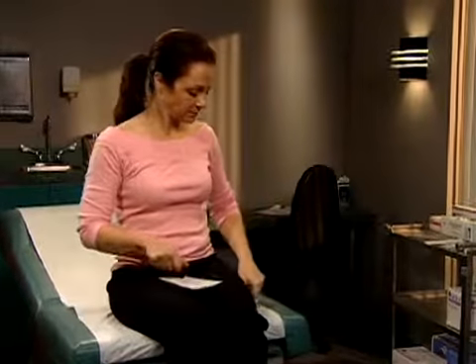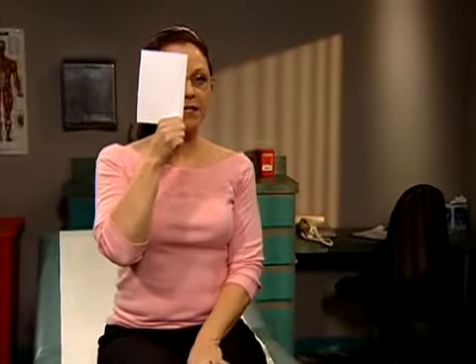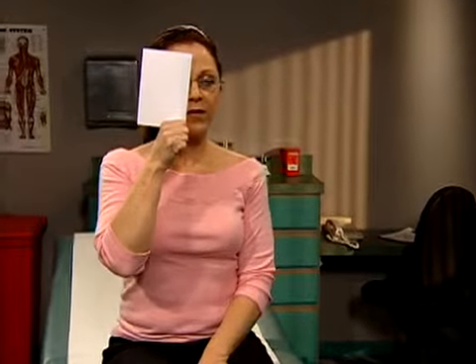Put your glasses on and cover your right eye with the card. That would be line 8. If you test the patient with and without corrective lenses, document the readings separately. Record the patient's visual acuity as a fraction.